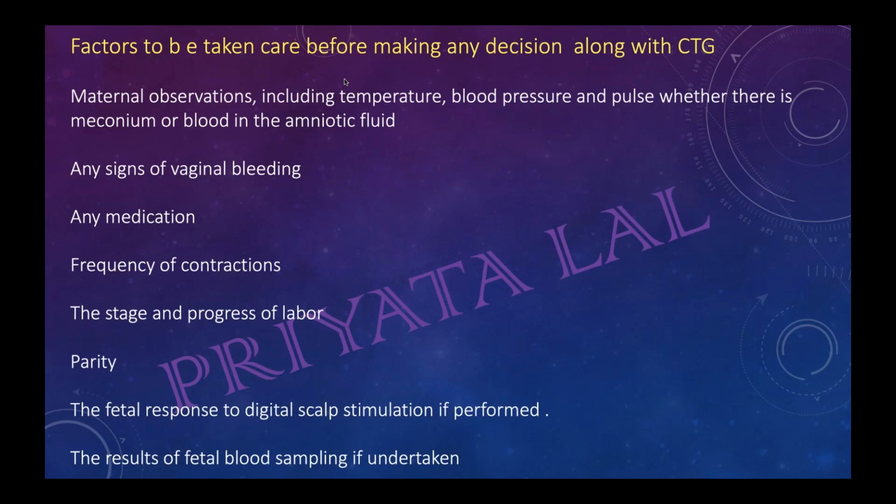With the oxytocin, it is an indication. Fine. So, Ankita, if it is a part 3 question, you can say, yes, we will put in heart rate monitoring. But for part 2, you cannot put epidural use because it is not there as a direct indication in NICE guidelines. I hope I have answered. Yes, ma'am, I got it.